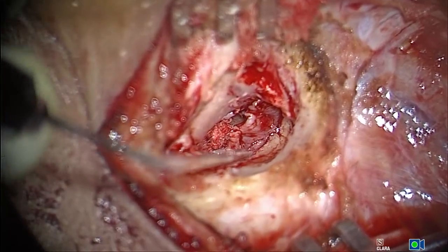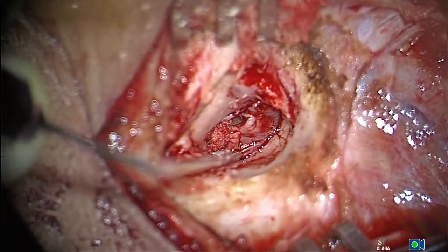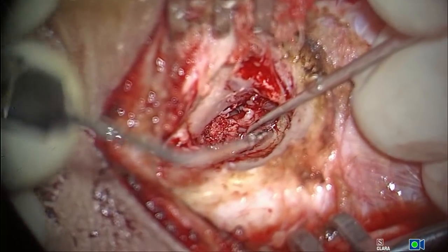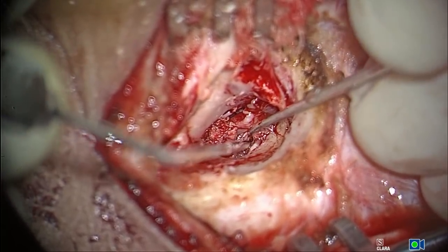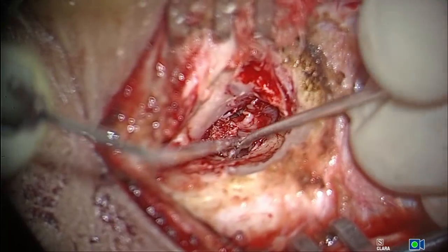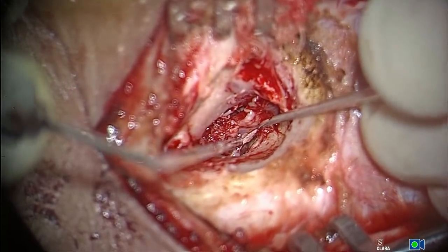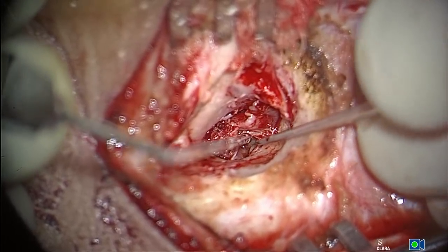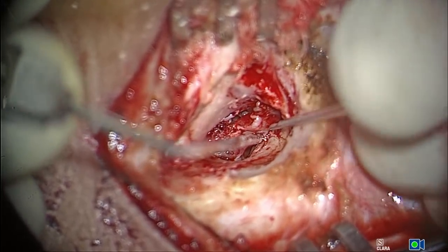If you have any doubts, you can ask me. This is a straightforward myringoplasty. There's nothing big. The idea is how nicely you perform it. And believe me, endoscopic ear surgery to me is not the answer, because you don't have one hand, and so the dexterity is lost.